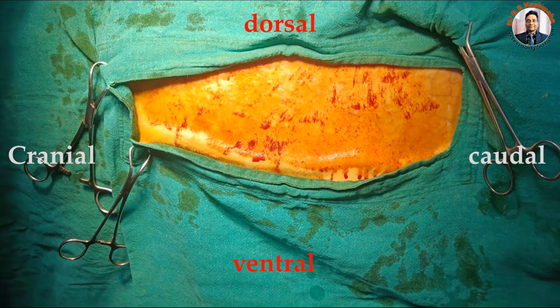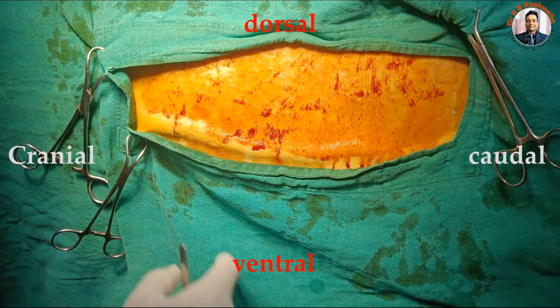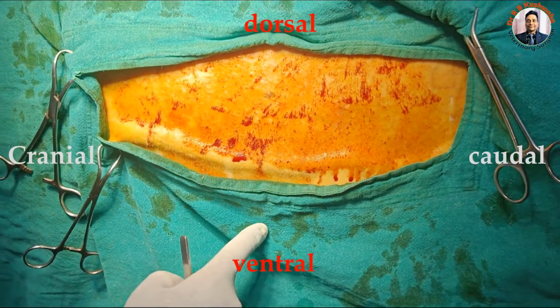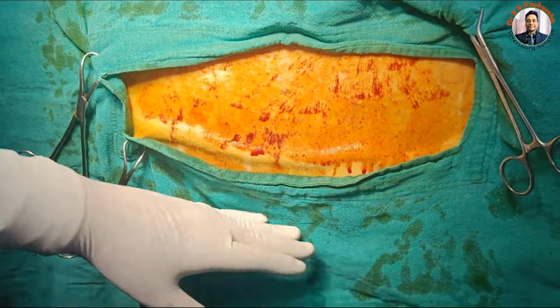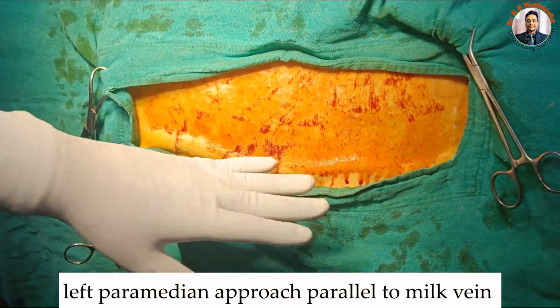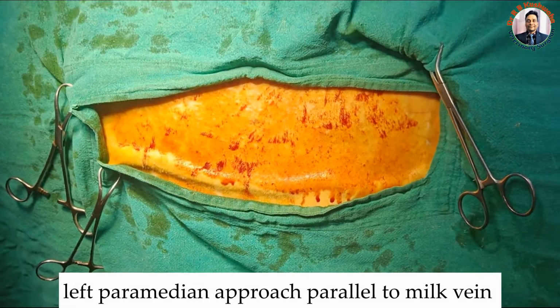There are different sites for the cesarean section in the cow and buffalo. Here you could see this is the milk vein, and just below the milk vein this is the midline. The incision parallel to the midline is the paramedian incision, and this is the most common surgical site for the cesarean section.